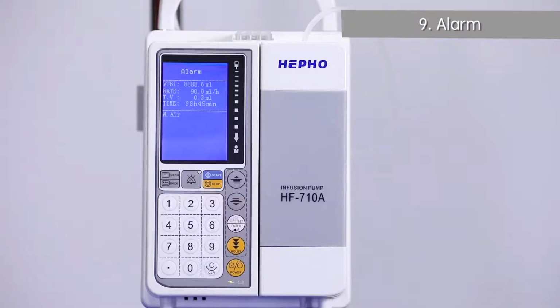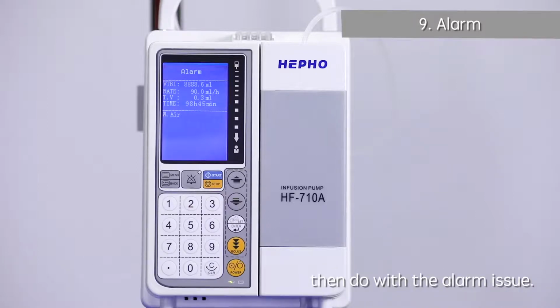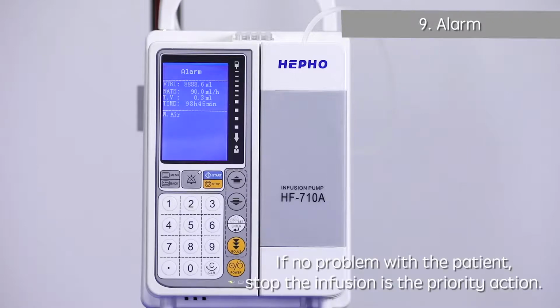9. Alarm. When there is alarm, observe the patient first to make sure the safety of the patient. Then, deal with the alarm issue. If no problem with the patient, stop the infusion is the priority action.